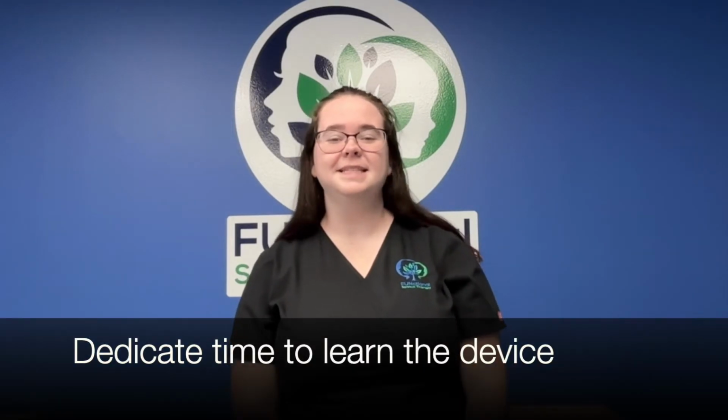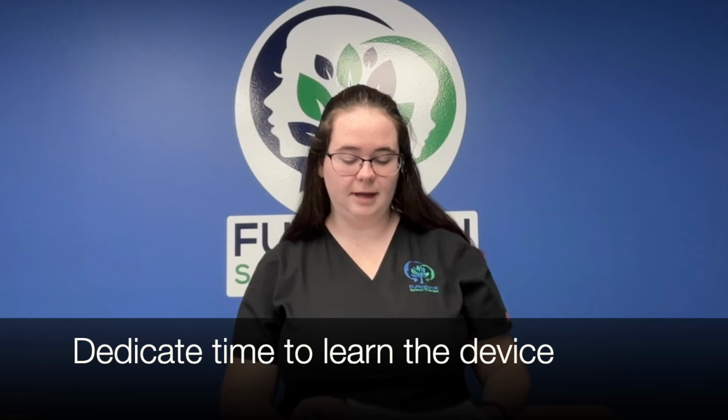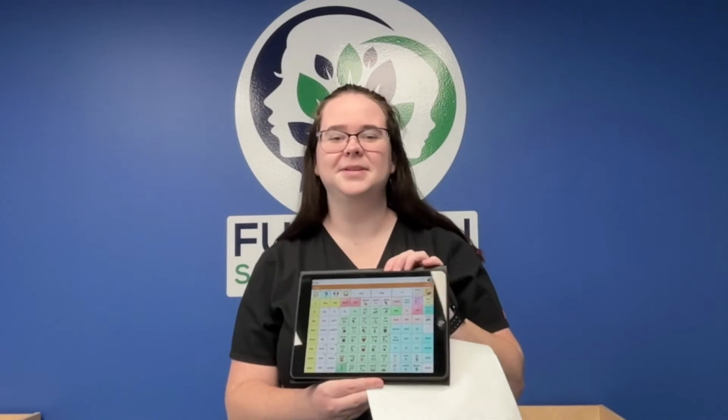Tip 5, take time to explore the system without your child. Now, it may take no time at all, or it could take quite some time to know the location of all of the available icons. We expect the user to explore the device and enjoy selecting buttons without a lot of meaning. Give yourself that same time. The better that you know the device, the better you can model it for your child.